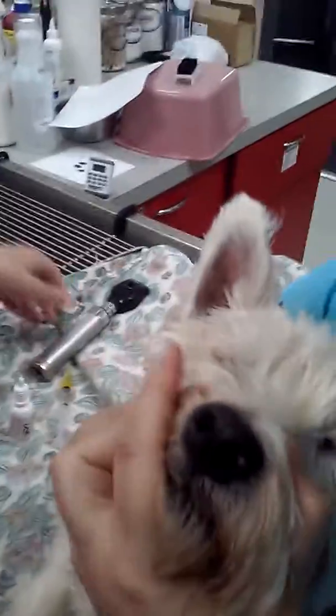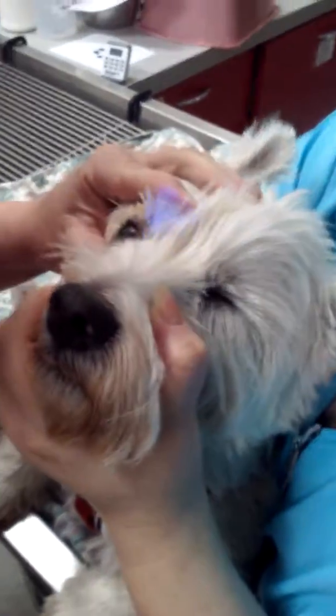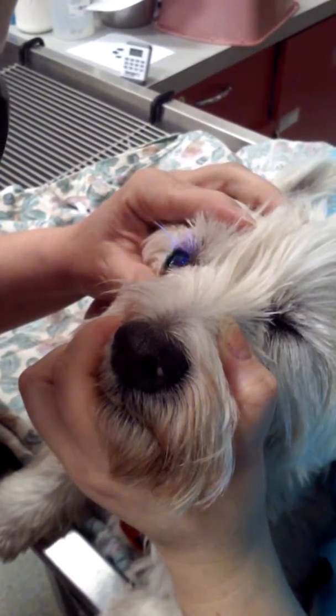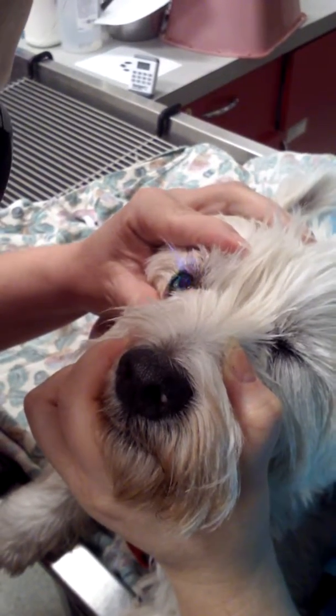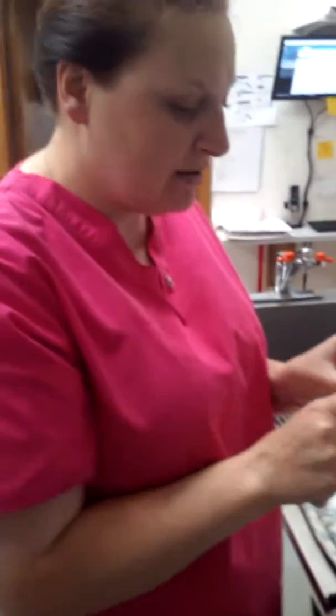Then we're going to go ahead and shut out our light, take a look to see if we can see any stain. While we're doing this we can also look for glaucoma. And that is how we do our fluorescein stains.